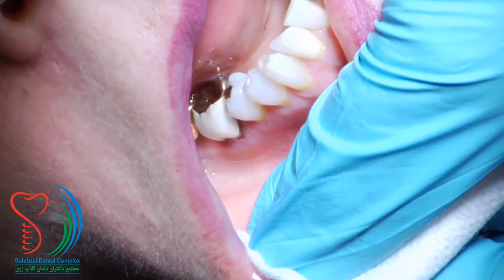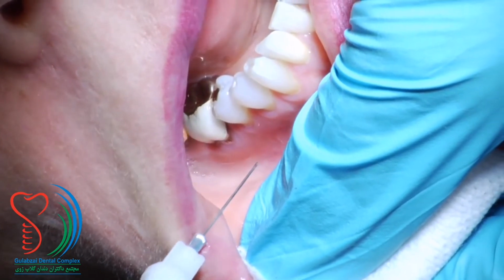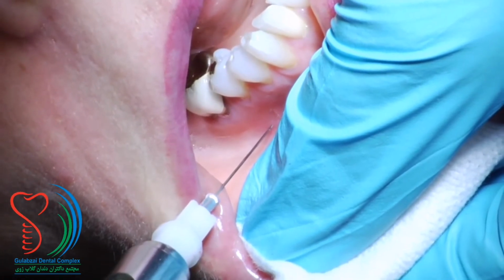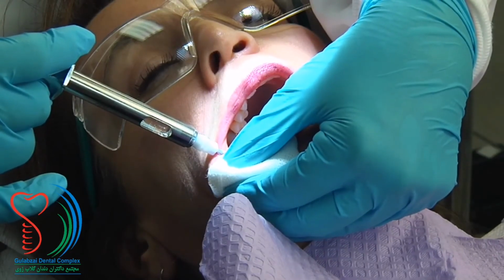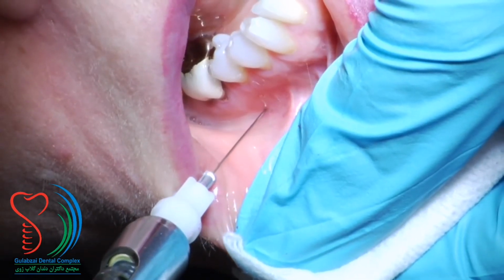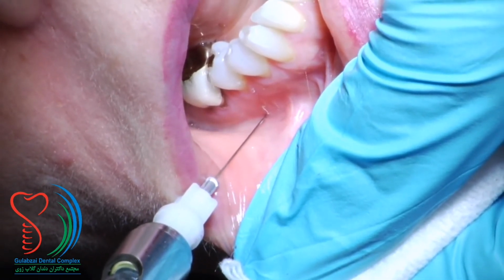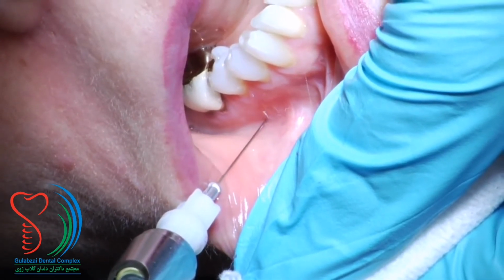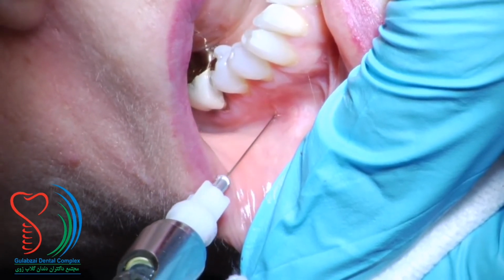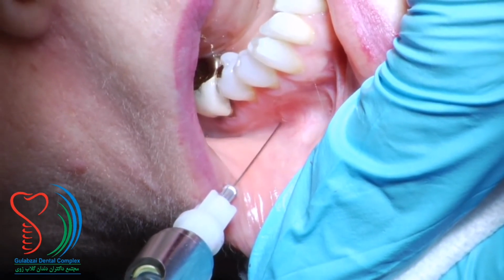The penetration site should be into the vestibular area in the region of the mental foramen, approximately at the apex of the second premolar. After locating the insertion point, align the syringe vertically with the patient's cheek to approach the penetration site, advancing the needle with a slight distal to mesial angle to accommodate the slope of the foramen. The depth of penetration is about 1/4 of an inch. After a negative aspiration, deposit about 1/4 to 1/3 of a cartridge slowly with multiple aspirations.